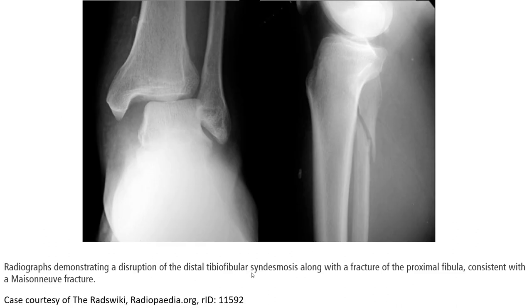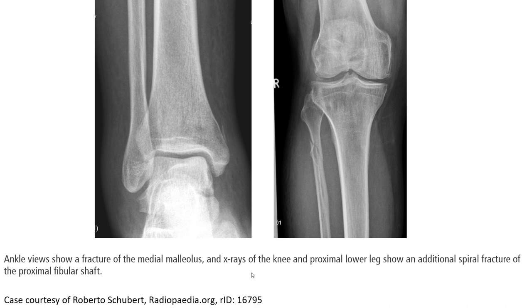This is an example of a radiograph which shows the disruption of the distal tibiofibular syndesmosis along with a fracture of the proximal fibula. This is a spiral fracture of the proximal fibula.